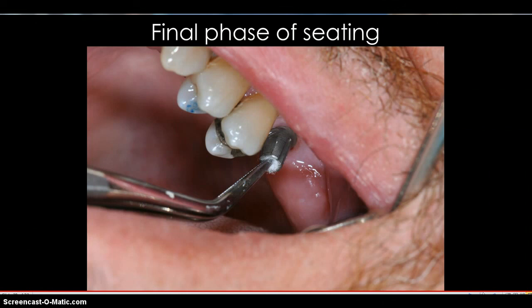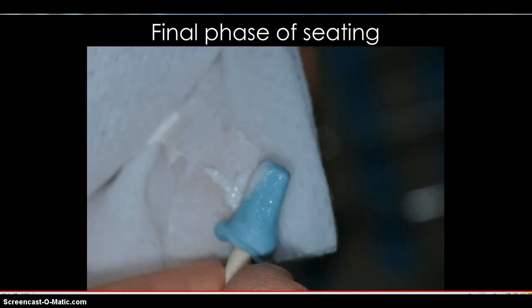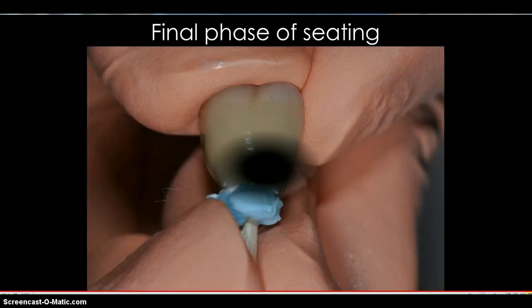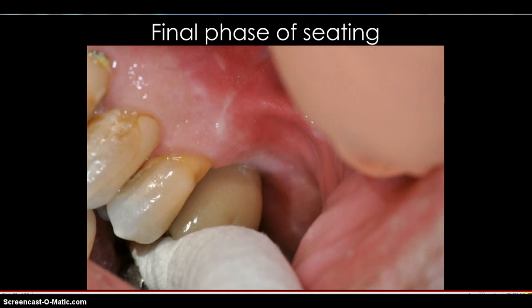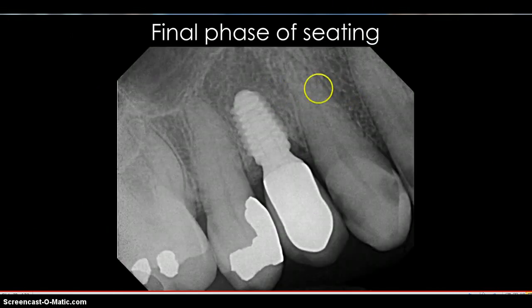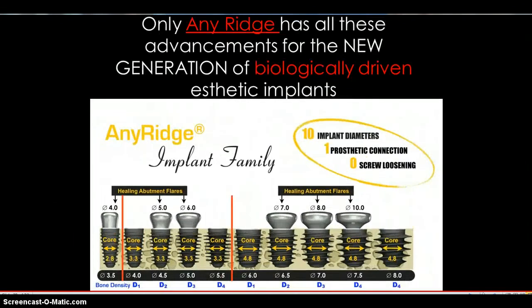And once we've done that process, you can put some cotton or composite or some other material, whatever you choose to use, to cover up that access hole. And we put some composite over that. There's your die, removing the excess cement. We can actually do it one more time to remove that little bit of excess yet again. And then we go to the mouth, and none of that excess cement is going underneath that tissue itself. Therefore, you have, again, complete control of your restorative process. Now, that whole thing is just a short synopsis of the final seating process itself.